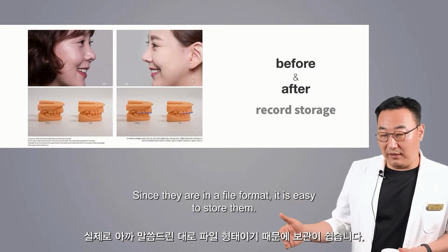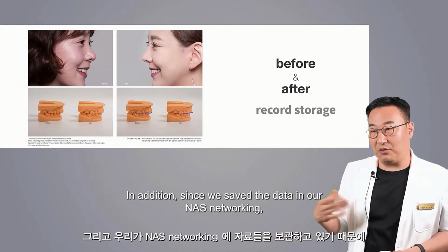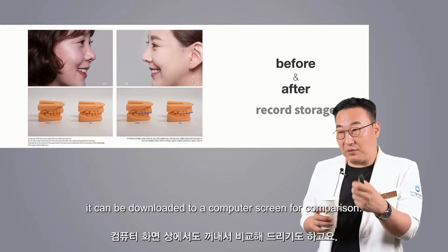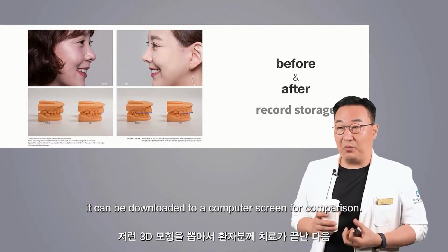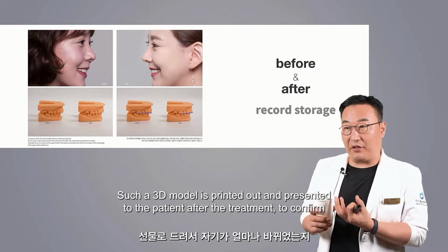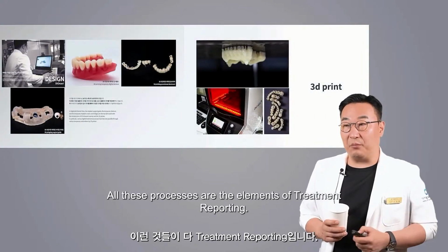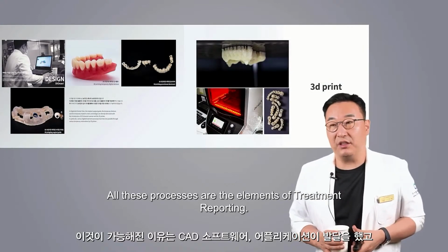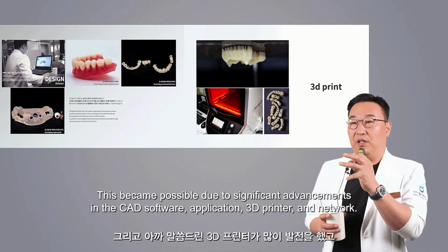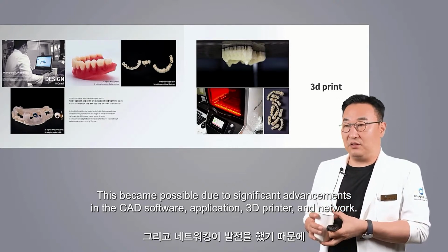Since they are in a file format, it is easy to store them. In addition, since we save the data in our NAS networking, it can be downloaded to a computer screen for comparison. Such a 3D model is printed out and presented to the patient after the treatment to confirm how much change has been made. All these processes are the elements of treatment reporting. This became possible due to significant advancements in the CAD software, application, 3D printer, and network.